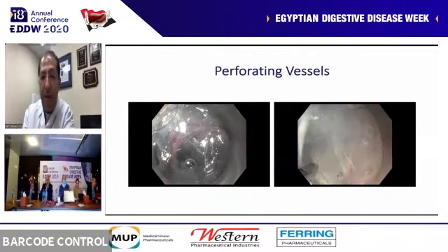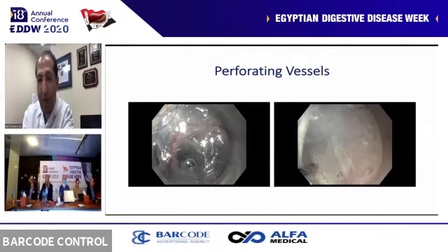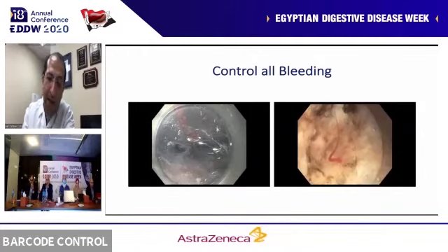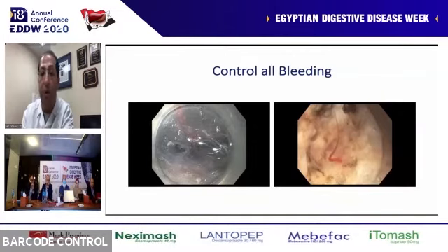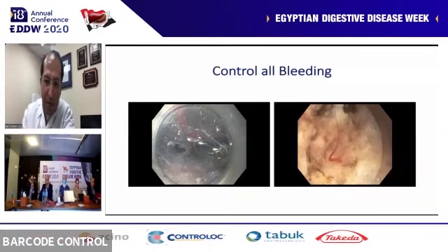You have to be very mindful and careful, seeing vessels through the third space. You have to coagulate those as you go. You cannot afford to have a massive bleed in a tunnel because it's a very tight space. You have to be very aware of very subtle findings. For example, a little tiny bleed to the right, you may see during regular endoscopy. It might not matter much to you, but in the third space, you have to be completely aware to control that bleed. I've had situations where I saw something little like that, ignored it and moved on, and within 30 seconds it filled my tunnel with blood, and it was very challenging to clean and look.